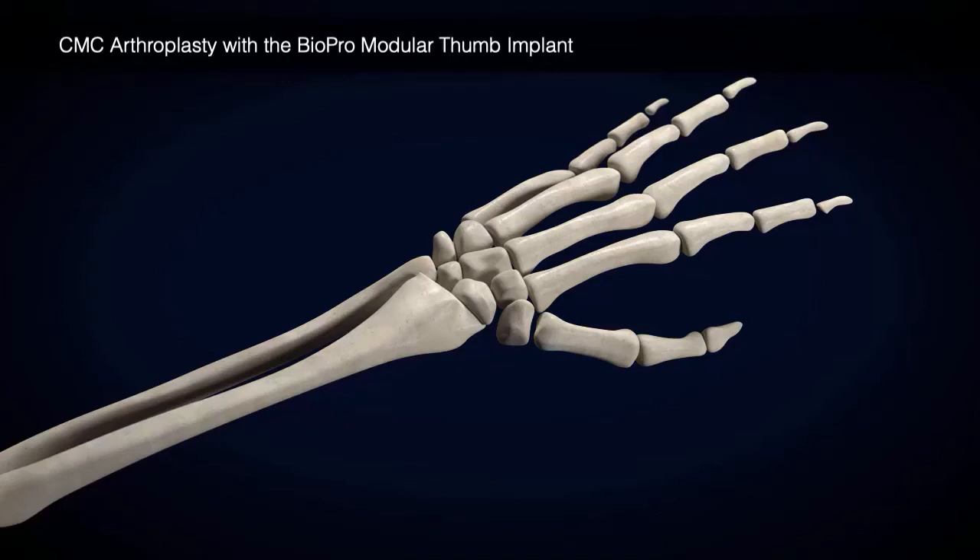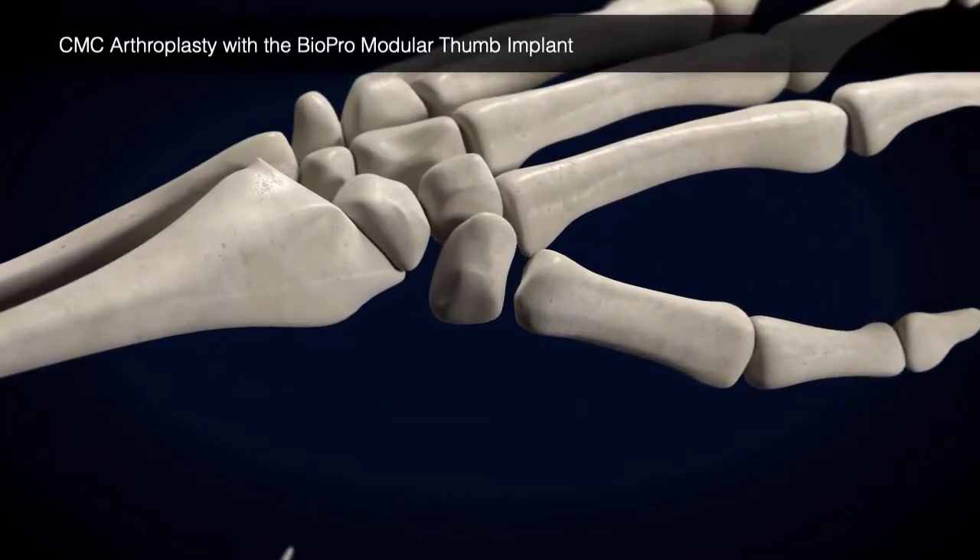The following is an abbreviated technique for CMC Joint Arthroplasty with the Biopro Modular Thumb Implant.